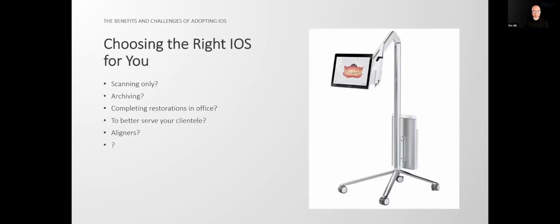So choosing the right intraoral scanning system, there's a few examples there, but I think what it's going to come down to is what you jibe with the best. There's a lot of these systems, let's say Trios or Itero or Electra or Sirona. All those softwares are different, and the analogy I like to make is some folks are Mac guys, some folks are PC guys. You can't convince the PC guys without threat of bodily harm that the Mac is better and vice versa. You cannot convince these folks to do it. It's the same with these scanners.